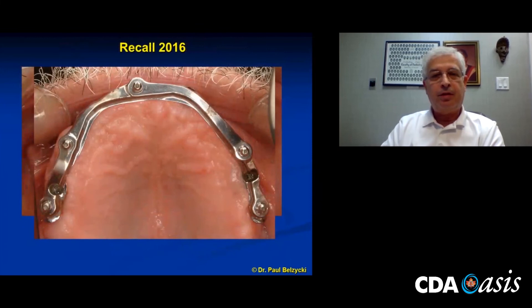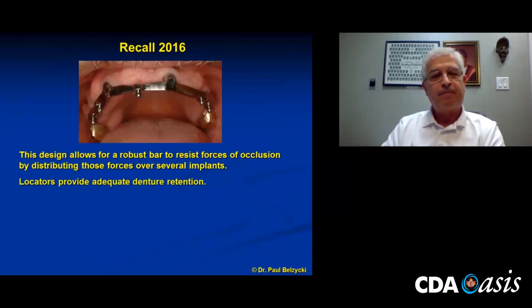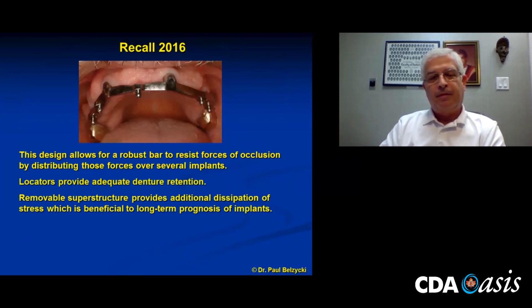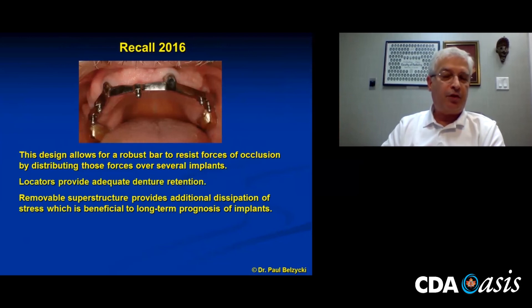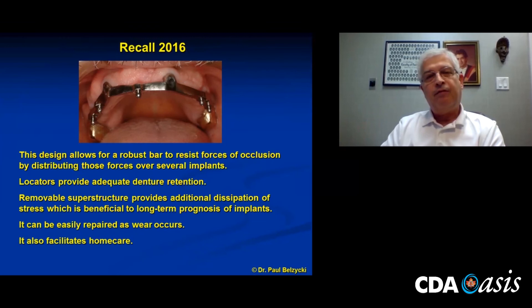This design allows for a robust bar to resist the forces of occlusion by distributing those forces over several implants. The locators provide adequate denture retention — it's never been a problem. Being a technician, I just give him a supply of locators and he can pop them in and out on his own. The removable superstructure is also a stress breaker, providing additional dissipation of stress, which is beneficial for the long-term prognosis and survivability of those implants. Components can be easily fixed if the teeth wear out, it's not a nightmare to repair, and it greatly facilitates home care — he can pop it out and clean in and around everything. His gums have never looked so good.